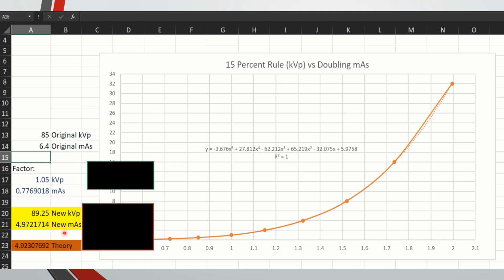And you can see I could put any kind of numbers in here and it comes out, okay? So 6.4 to 5, that's the next step, which, in radiographic physics, we'll talk about the generators, and you can learn why there's different steps of mAs if you pay attention on the console, when you're setting a fixed technique, why there's different sets of mAs that are available. It will be discussed in physics. But 6.4 to 5 is the next step, okay?